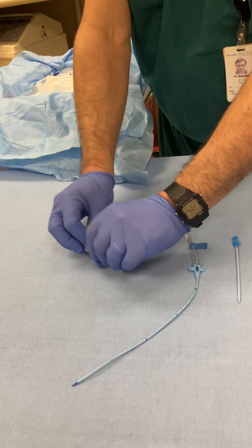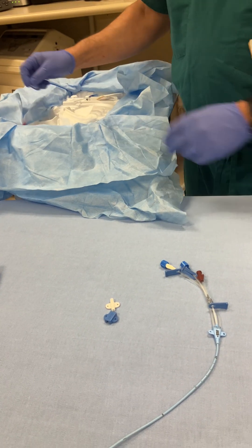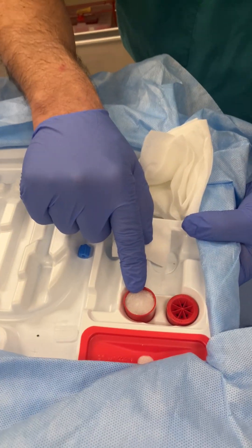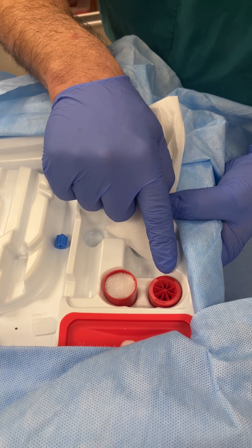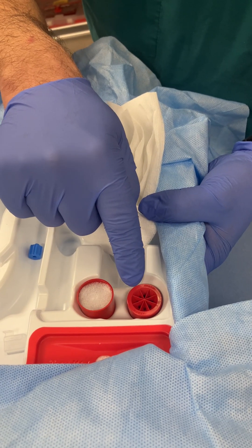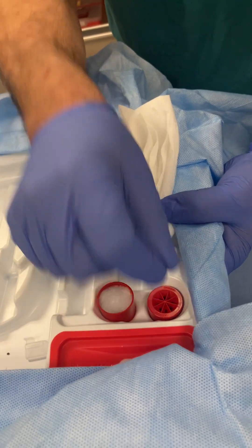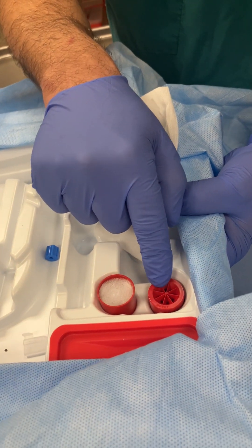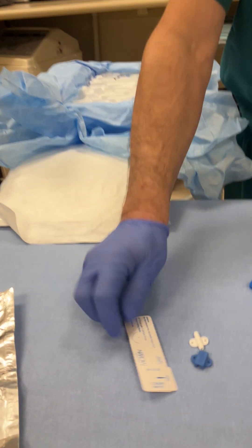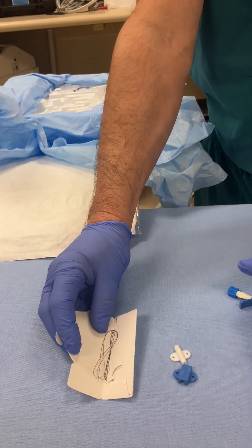After the catheter is in place, I'm going to use some additional catheter locks. I also want to point out that these two devices both protect your sharps after use. However, this one locks the needle — if you place a needle in this needle holder, it's going to clamp and you will not be able to reuse that needle. So make sure you don't use this unless you know you're done with that needle. The last thing you would do is suture — there are also staples — but you would suture the catheter in place.